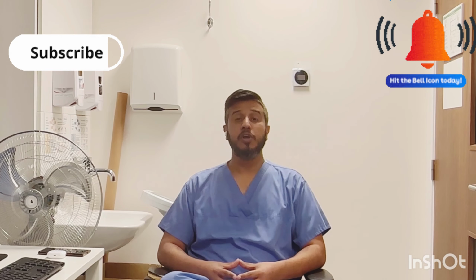Abdurrahim here with you. So we are continuing our mitral regurgitation topic and I was explaining to you the parameters of mitral regurgitation. Today I'm going to explain some more parameters, but the parameters I explained in the last 2-3 vlogs are the main parameters to quantify mitral regurgitation.